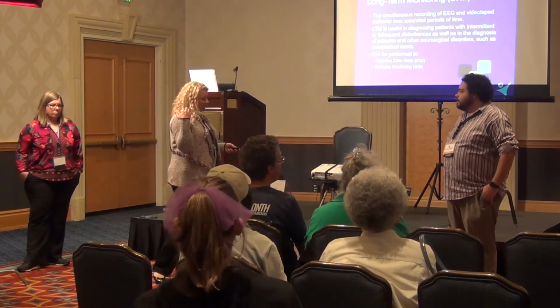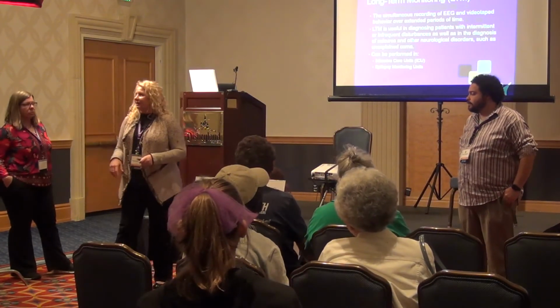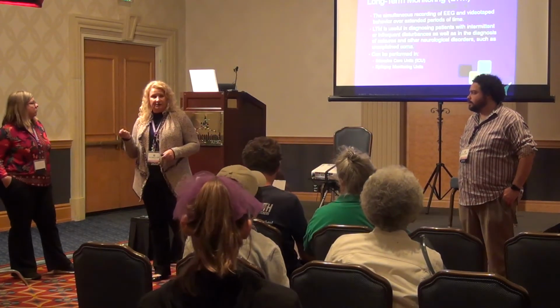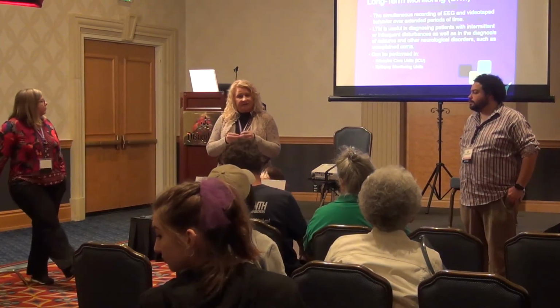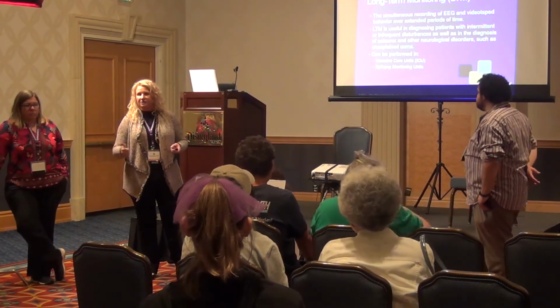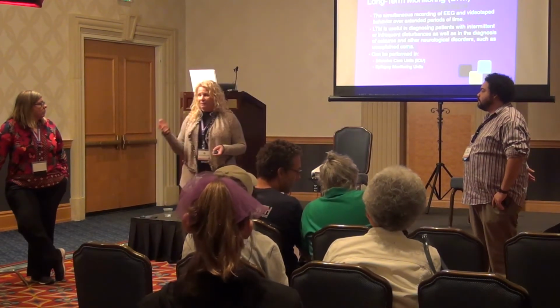So just so you get an idea, when you come into an EMU, if you will, the role of a technologist is that we are there on a daily basis, if not every few hours, once the electrodes are placed, ensuring technical integrity, monitoring your brainwave activity, as well as the video recording, to ensure patient safety. For the events that we capture, we are simultaneously able to see the clinical behaviors as well as electrographic changes at that point in time. It's a multidisciplinary approach. Your physicians will be coming in, nursing will be coming in, and your technologists will be coming in. This can be done in an ICU setting as well, where, from a technologist standpoint, we are able to record 24/7.